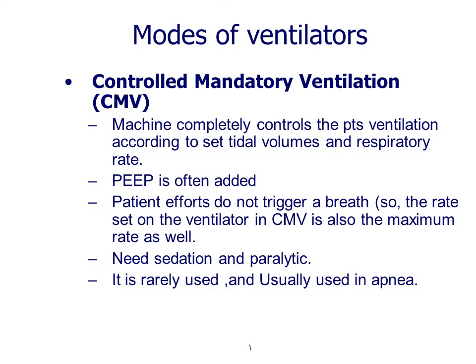Modes of ventilator, which means the way that this ventilator works. كيف بيشتغل هذا الفنتليتر. The first mode is the controlled mandatory ventilation, CMV. The machine completely controls the patient ventilation according to set tidal volumes and respiratory rate. الفنتليتر هو المسؤول عن إعطاء المريض بشكل كامل التايدال فوليوم والريسبيراتوري ريت، والمريض لا يشارك بأي effort.